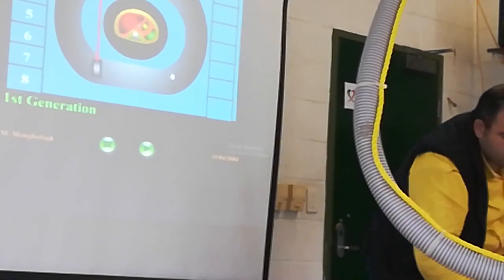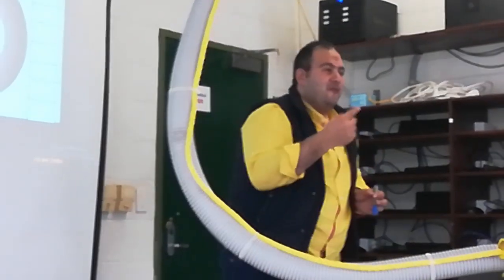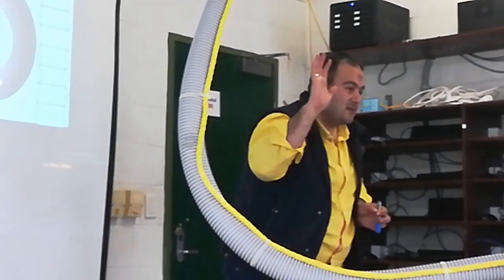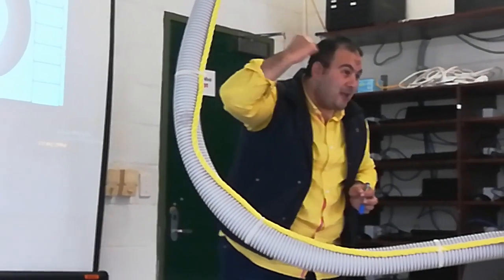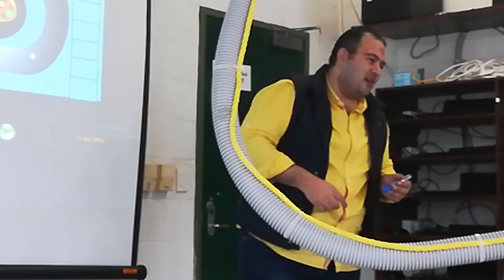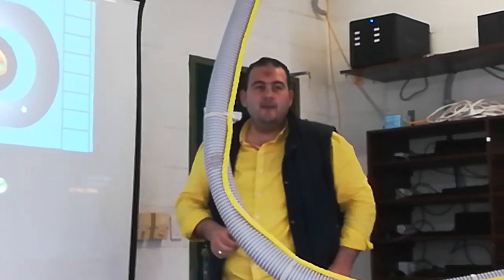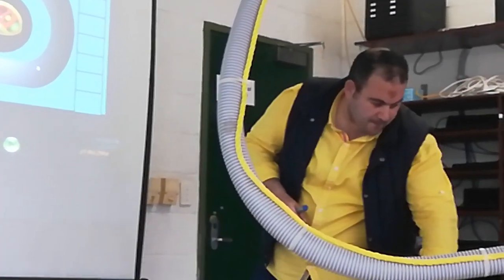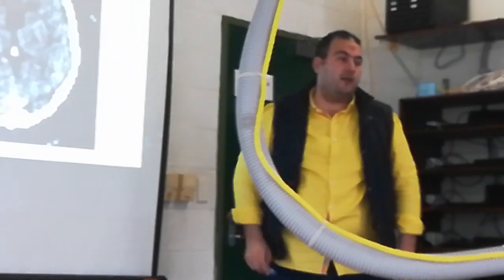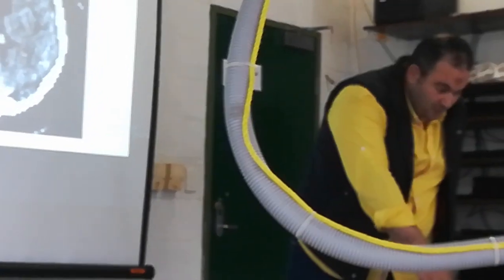So the time was of how long? A few hours, for the first image. Okay, first image, first slice, 5 minutes. So if you have 20 slices, you need 100 minutes, more than 1 hour. The first image for CT, this is the first one, 1970. It's not bad.